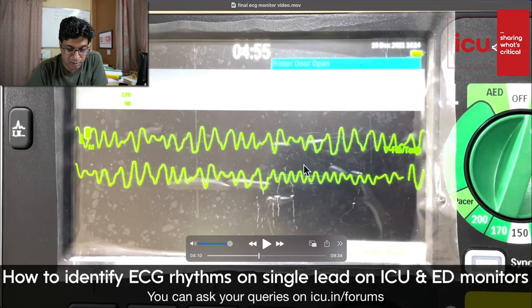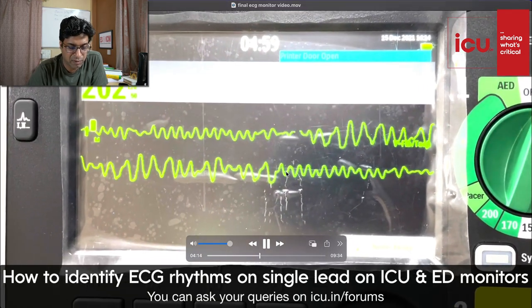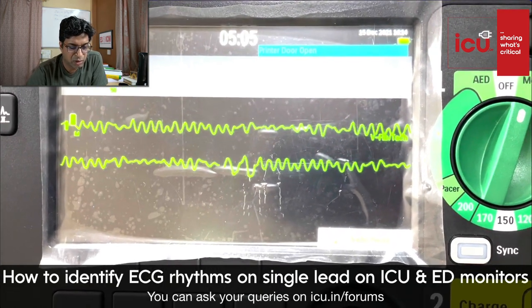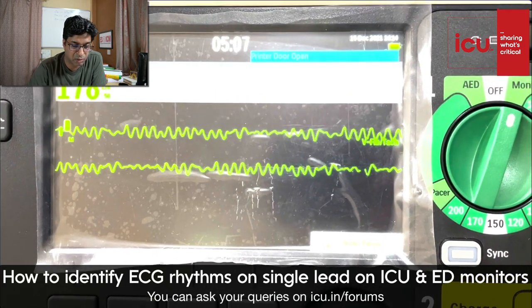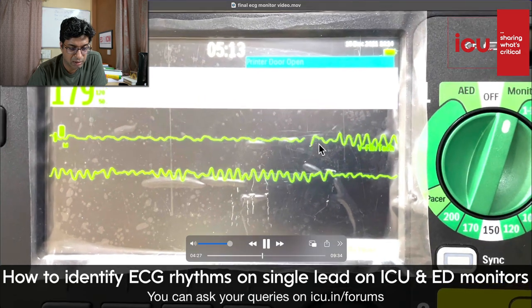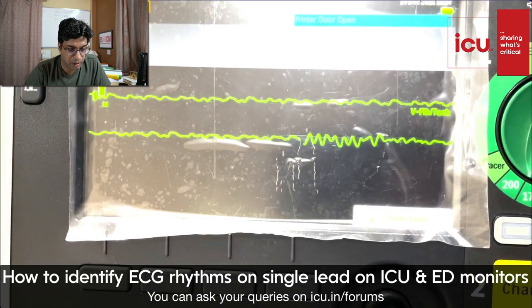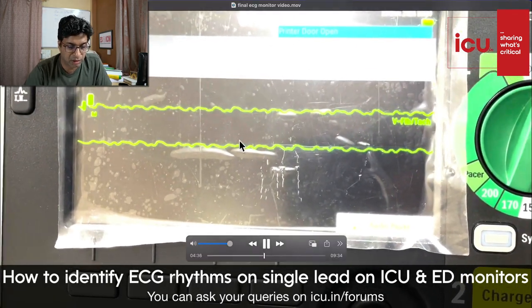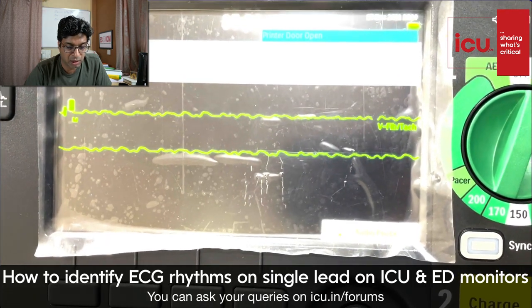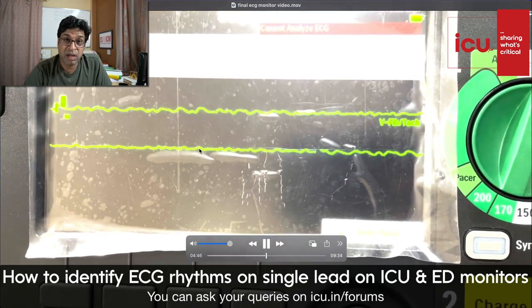Oh, the complexes, you see, have become fine. So it's a fine VF. In fine VF, the complexes are very small. Previous was coarse VF. This is fine VF, a deadly rhythm. Okay. So this is VF. The patient is going to collapse or has already collapsed. If we don't treat, we will get a flat line.